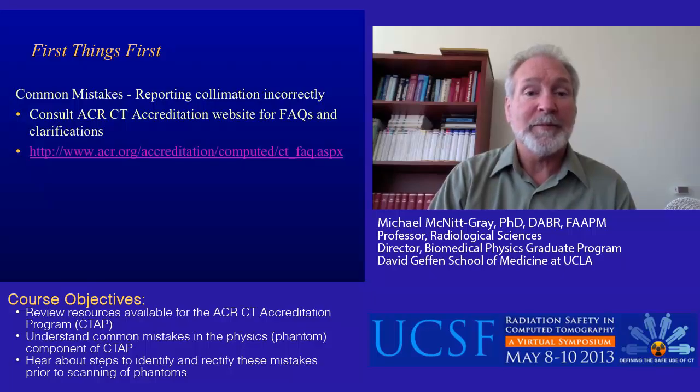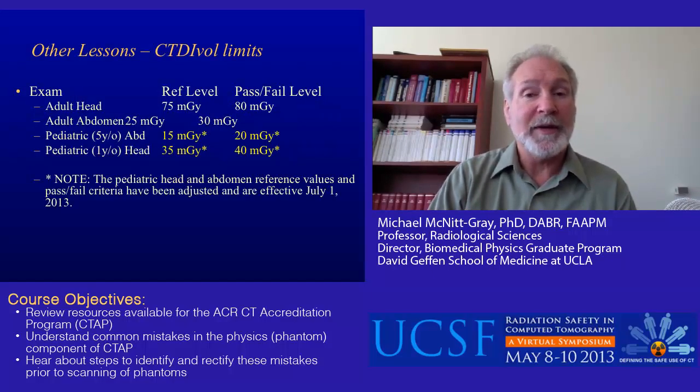Next. Some other common mistakes about reporting collimation correctly are described, and you can consult the ACR CT Accreditation website for those FAQs that were mentioned before. There's a discussion in there about several different scenarios for collimation and reporting it correctly. Next. Some other lessons. The CTDIvol limits.